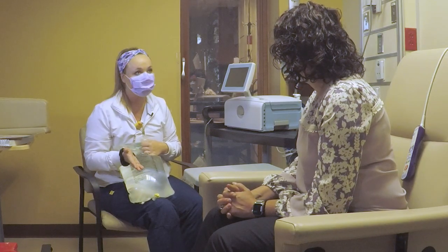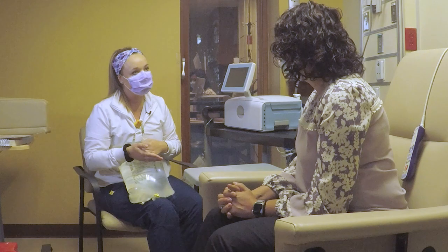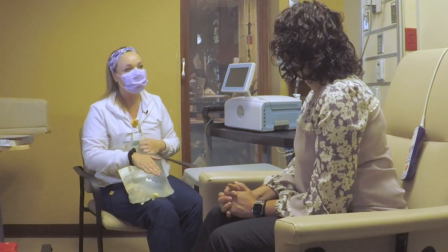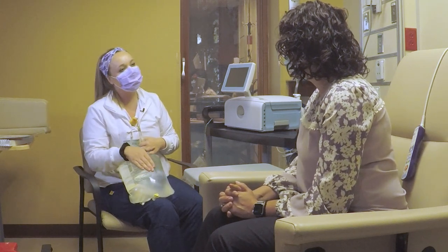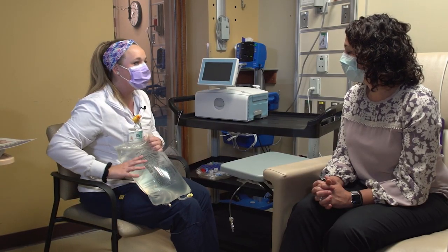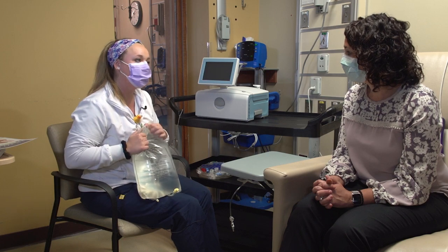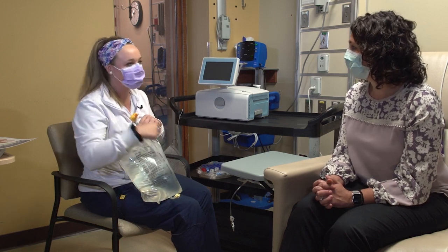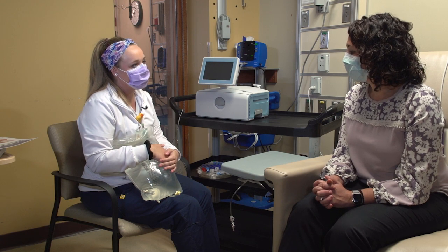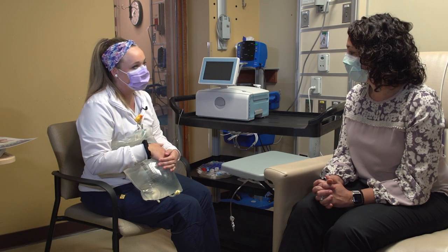So typically we start off on a green solution, and then if you're a little bit too dry, we're pulling too much fluid, or you're dehydrated, we'd use the yellow. And then if you have too much fluid, we would use the red solution. Then we got the purple, and that would kind of be an all-day dwell, but typically our new patients don't start off on something like that. So then we would be able to educate you on that further if you ever needed it.